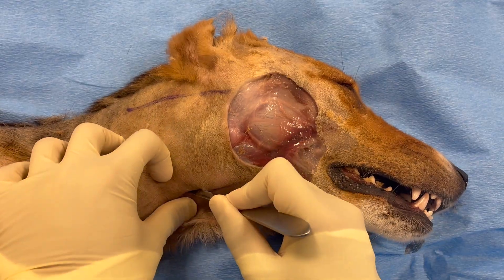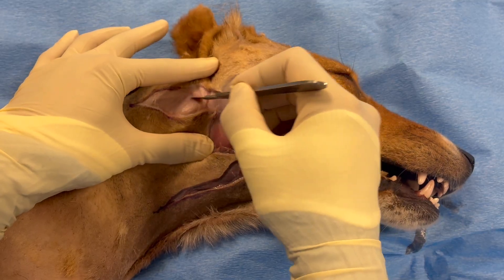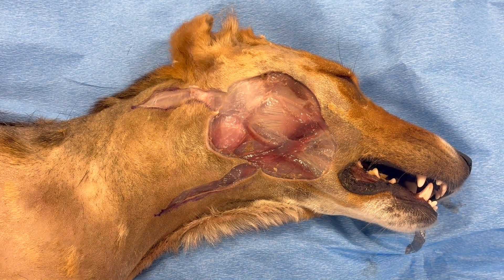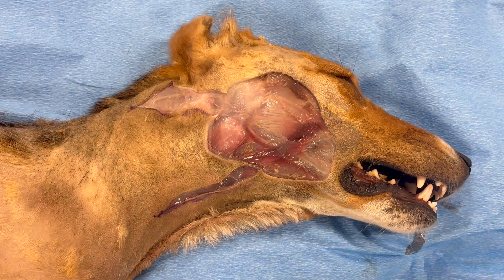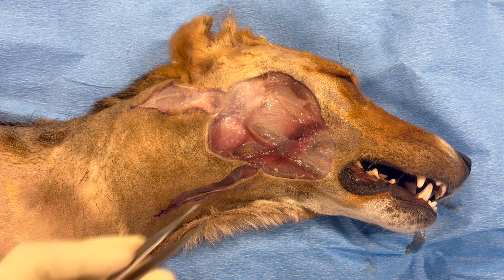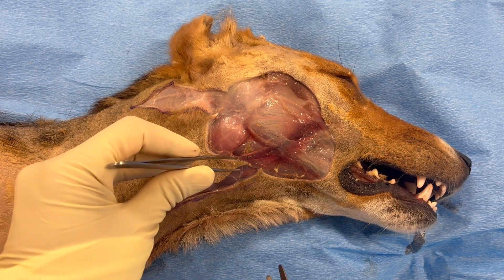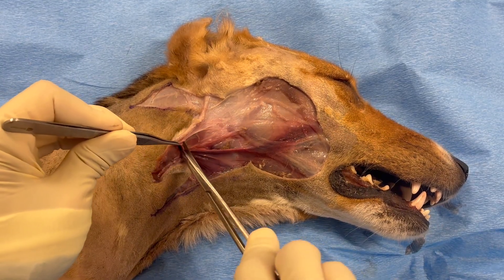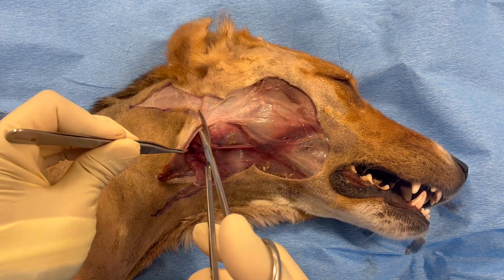Here we're making our skin and subcutaneous incisions, and then this flap of skin is going to be completely elevated from the underlying tissues. Just like with all of these types of flaps, we want to keep as much of that underlying subcutaneous tissue and panniculus muscle — some of the platysma in this case — along with the flap.